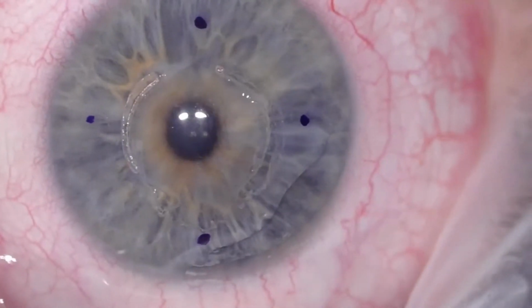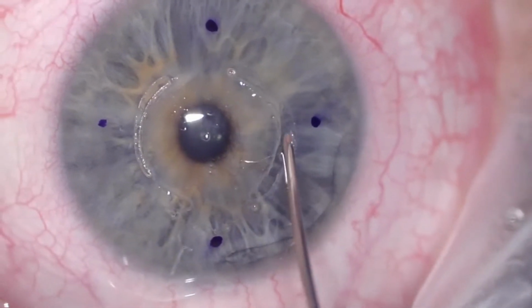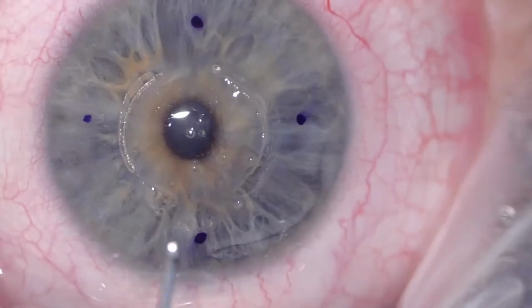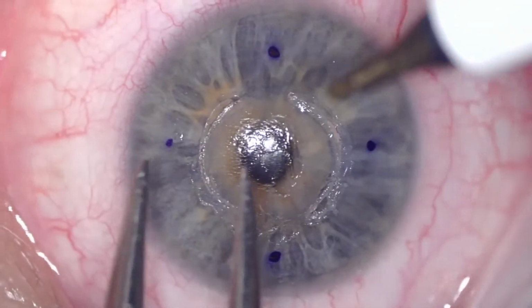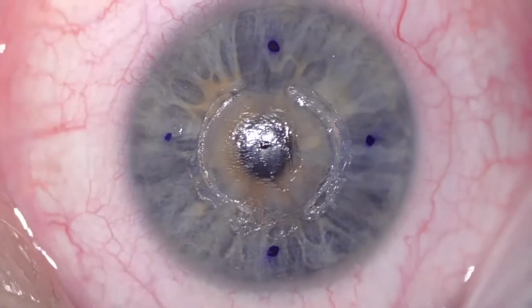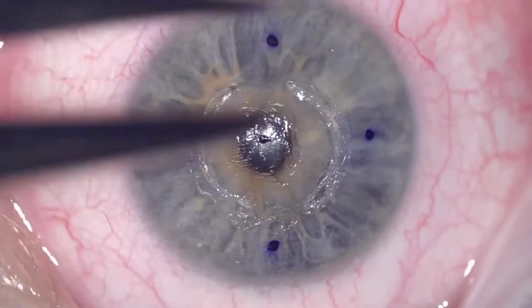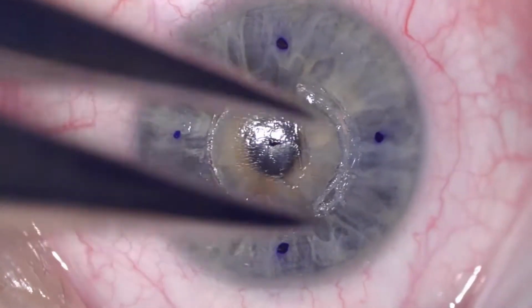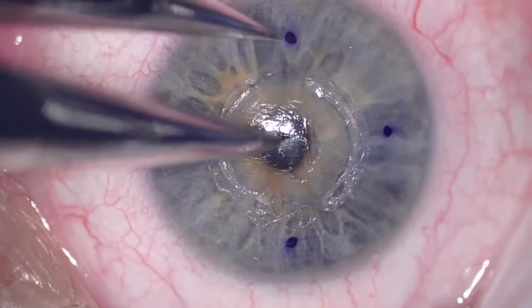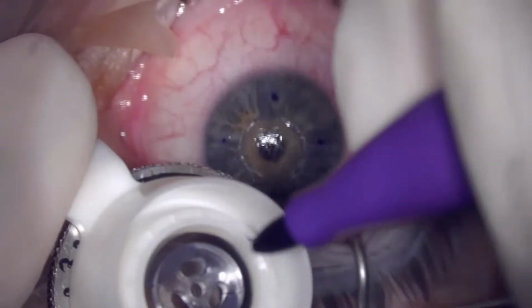Just spraying the surface with a bit of BSS to make sure my view is adequate. And then I'm going to dry this area and mark the center. It's important you mark the center because sometimes the center point is all you have when you put the trephine on. So you want to make sure the trephine is as central as possible, especially when you have made the size of the trephination just enough to cover the diseased cornea. You don't want it to end up being beyond this point.